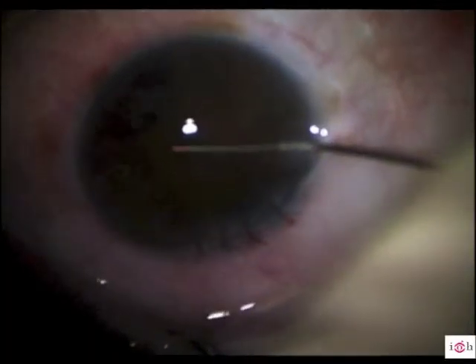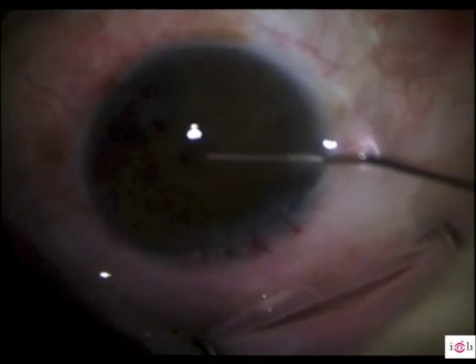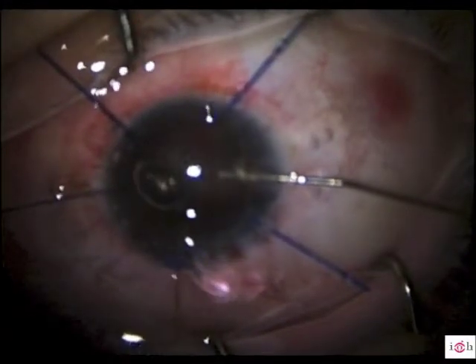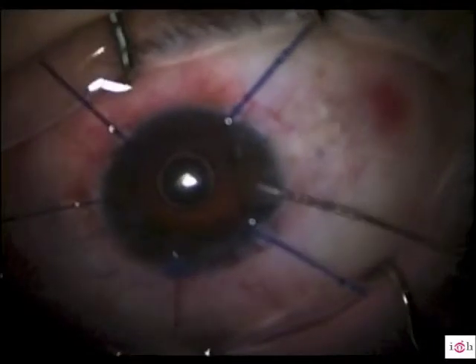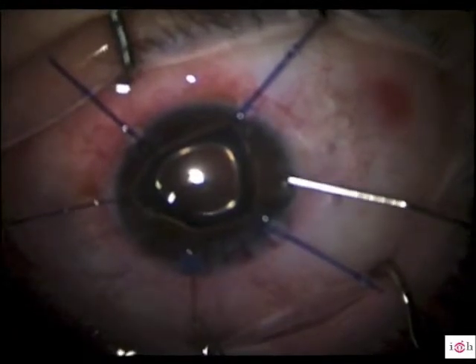The cornea was losing its transparency during the surgery, and at that point visualization was very difficult. With viscoelastic, we opened the pupil at one small point. Then, with the spatula, we managed to release the pupil completely. Grieshaber disposable iris retractors were used to dilate the pupil. We washed the visco with irrigation.